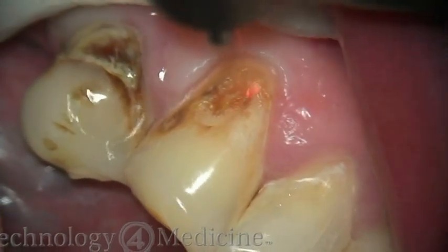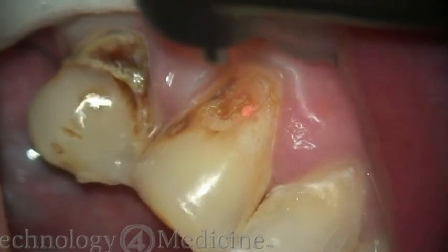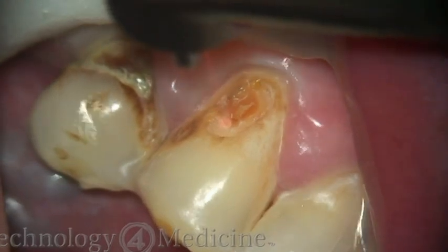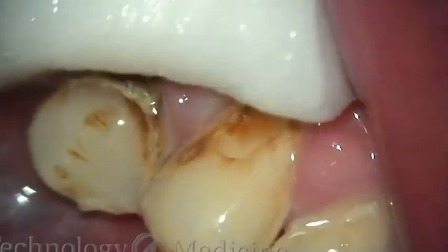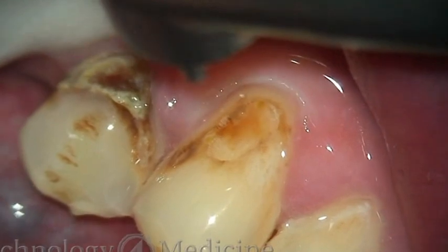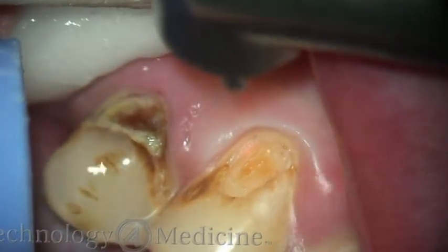I can change the setting on the laser to 50, which is a very short microsecond pulse duration. It allows me to use very low energies. It doesn't allow the nerves in the tooth to fire, so I can actually prepare and remove decalcified and decayed tooth structure in an area that would normally be quite sensitive. The patient feels a cool or cold sensation rather than heat.